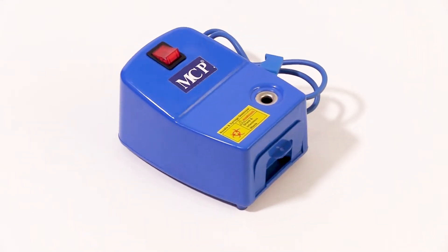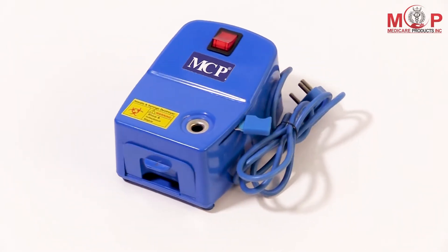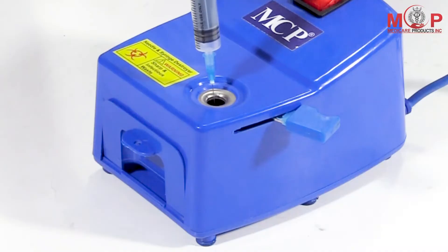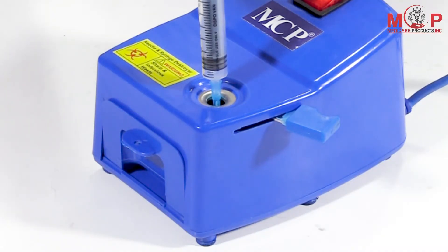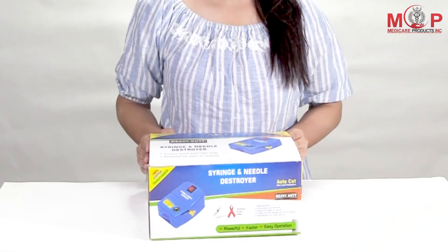Presenting MCPABS Body Electrical Needle Syringe Destroyer. Needle Syringe Destroyer is an instrument that helps in prevention of HIV AIDS by destroying the needles and barrel of syringes so that it is not reused.